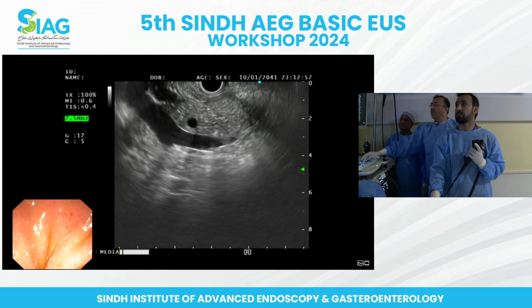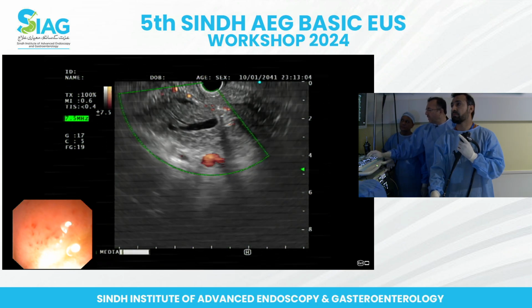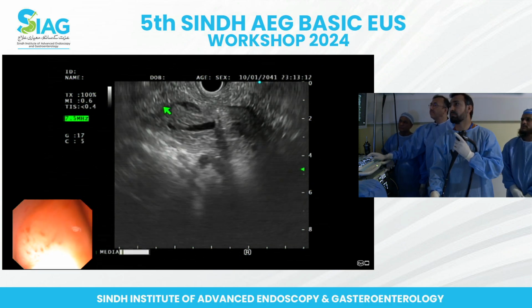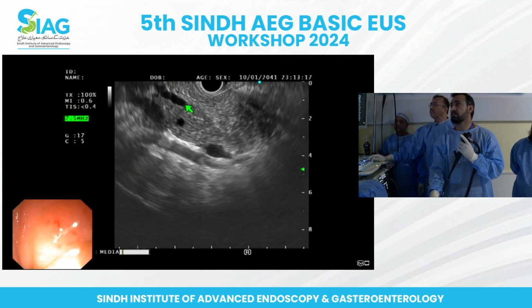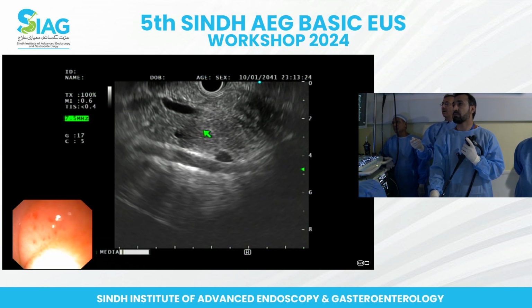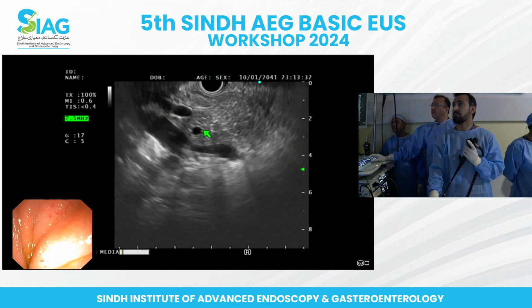On the top, we expect that you should be having CBD. So right here, that's what I was mentioning. Okay, this is the pancreatic duct, and you need to bring to a place where they are very close to each other. Okay, so big wheel slightly away from you and rotation. Okay, very good. That's what you're doing. Very good. Excellent. Try to bring it close to each other.